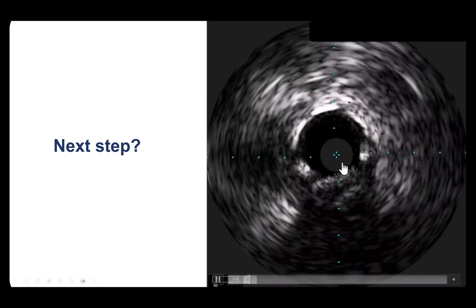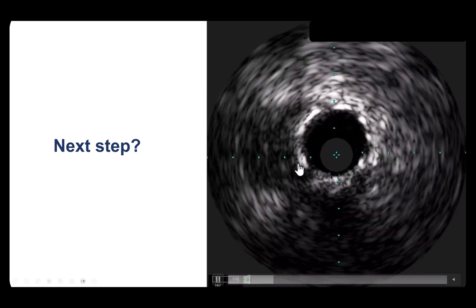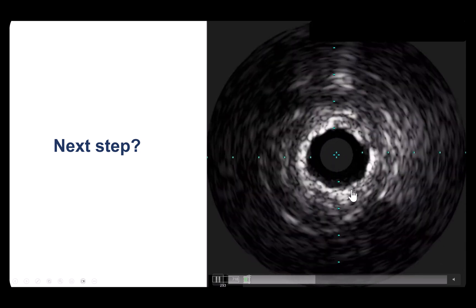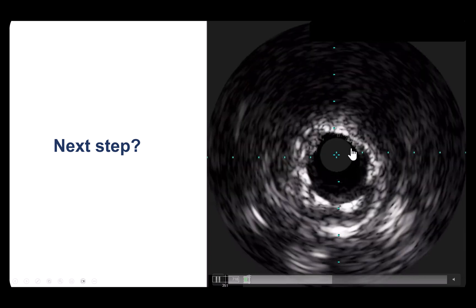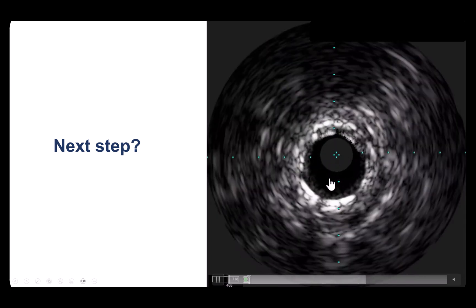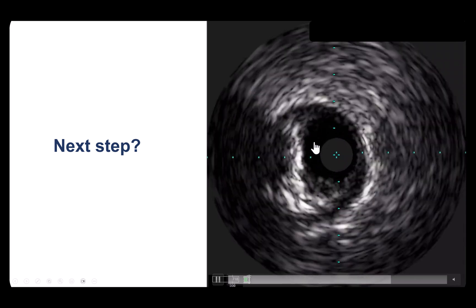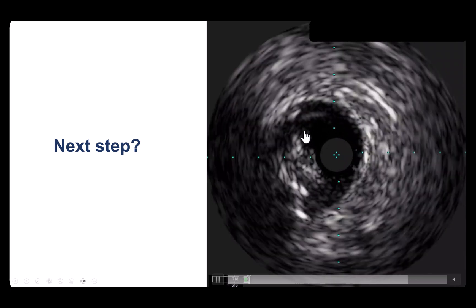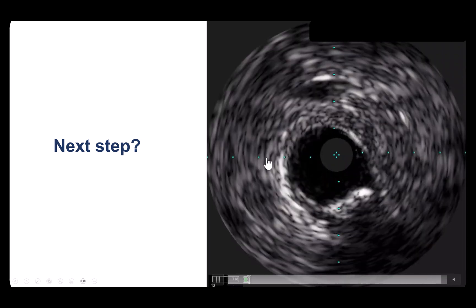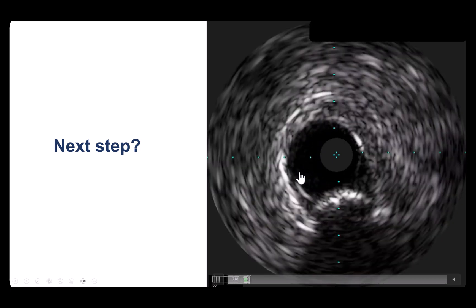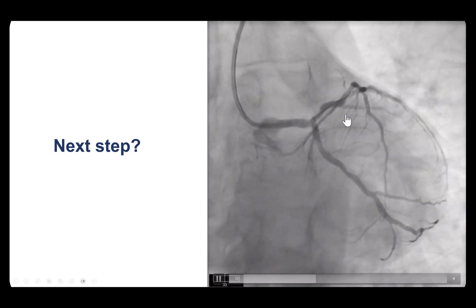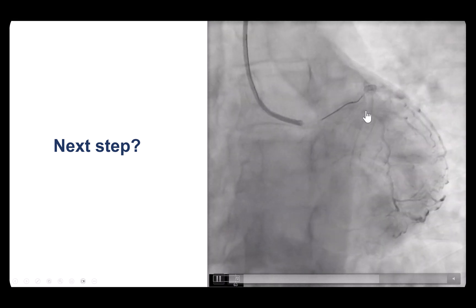What we see on post-stent IVUS is the distal vessel with the stent visible. As we come more proximal, there is a lot of plaque behind the stent and there may be some stent under-expansion. The stent seems to be a little better expanded more proximally. At the proximal edge of the stent, we see quite a bit of plaque burden, which may become relevant to the subsequent events.